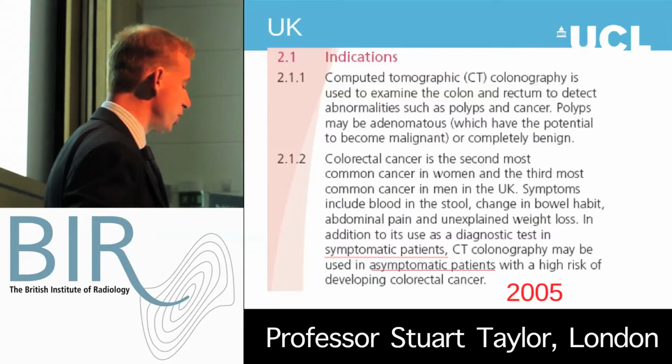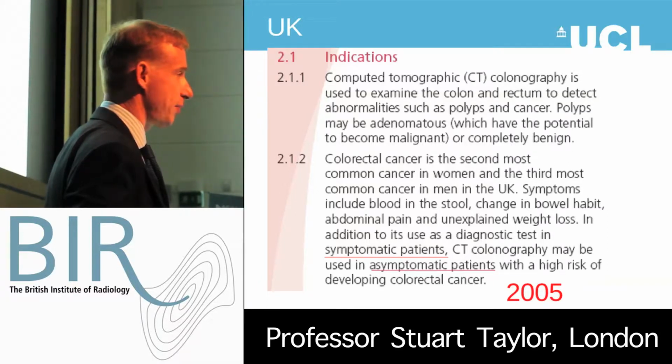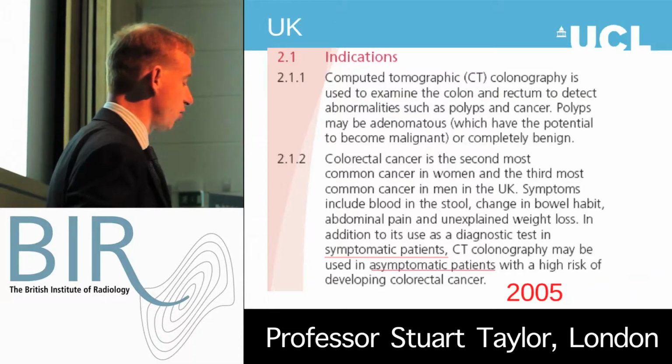And so as early as 2005, NICE, which governs everything we do in our day-to-day lives, actually says CT colonography was fine for symptomatic patients, and it even got it in for asymptomatic screening patients. That's back in 2005, whereas in the USA, as late as 2009, CT colonography is still not reimbursed by the major insurance companies, so therefore radiologists don't get paid for doing CT colonography.